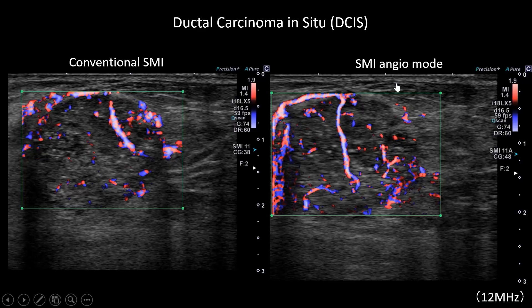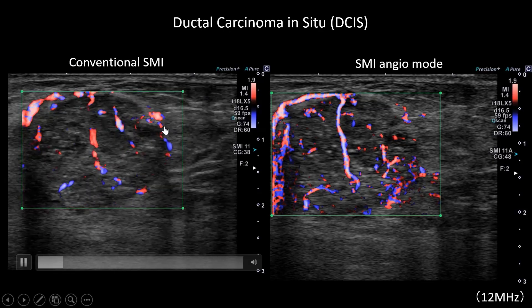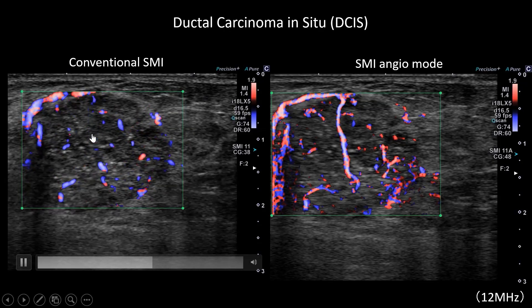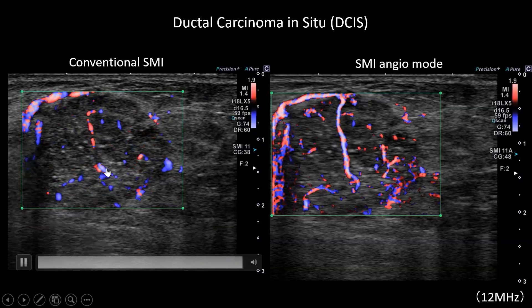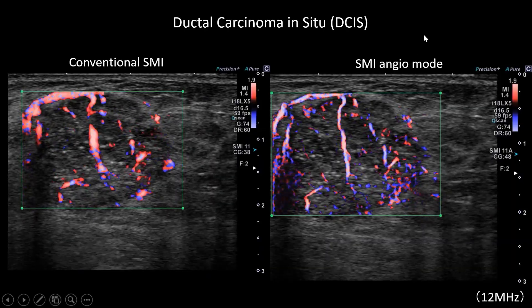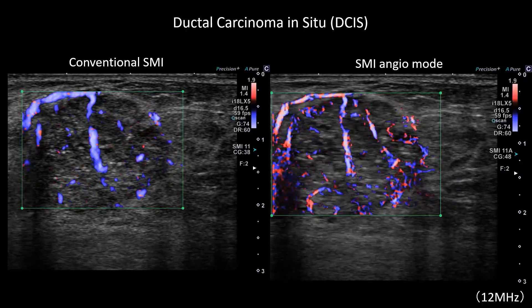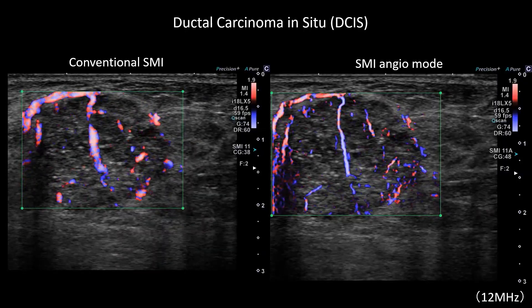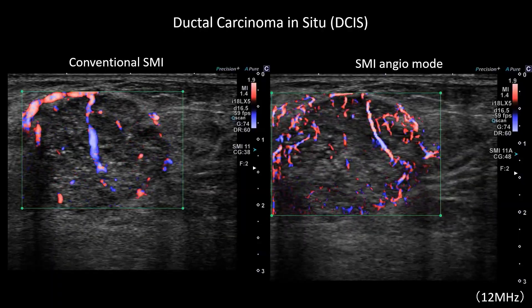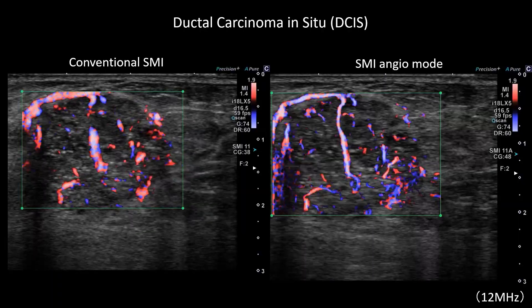This is a case of DCIS breast cancer. With conventional SMI you can see some of the vessels. By using SMI Angio Mode you can see the continuity of each vessel, and the sensitivity has been improved a lot.